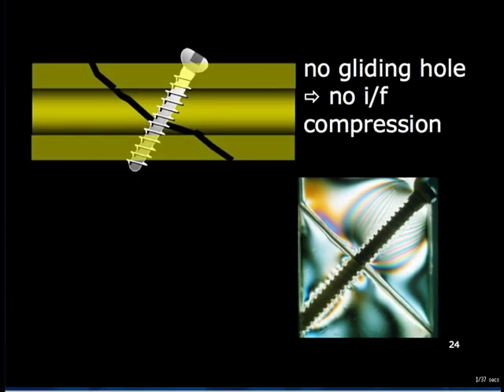If we insert a screw across a fracture plane with a view to closing the fracture gap and applying a compressive force at the fracture plane, there are certain conditions to be met. If we thread both the near, cis, and far, trans, cortices, the compression will not pass across the fracture plane.